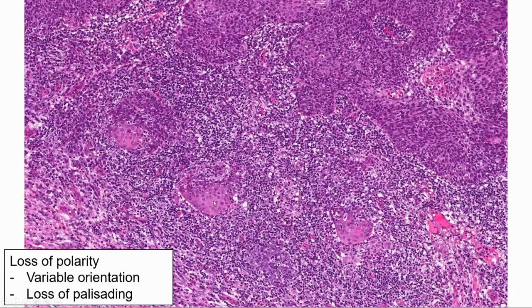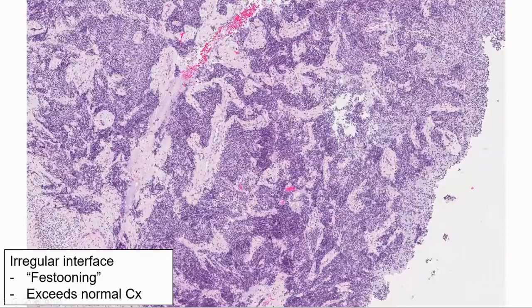You can see that loss of organization and that paradoxical maturation of early stromal invasion in this particular case. Again, look at the distribution of the nesting. This population particularly is not showing squamous differentiation, is not showing paradoxical maturation, but nobody would call this in situ because the architecture and the distribution of the nesting is very irregular and confluent.